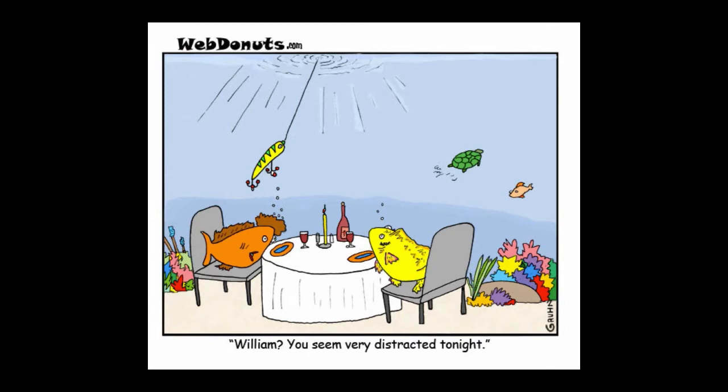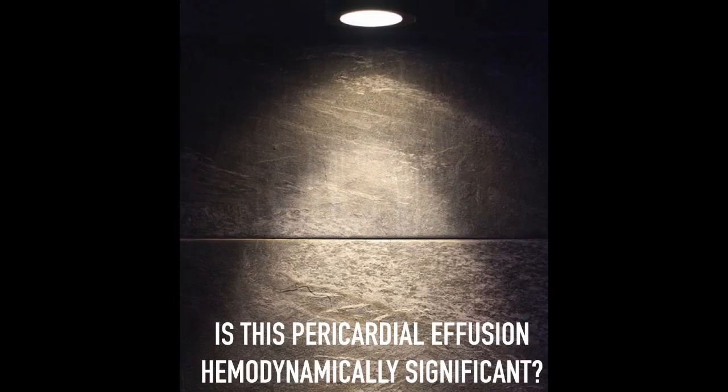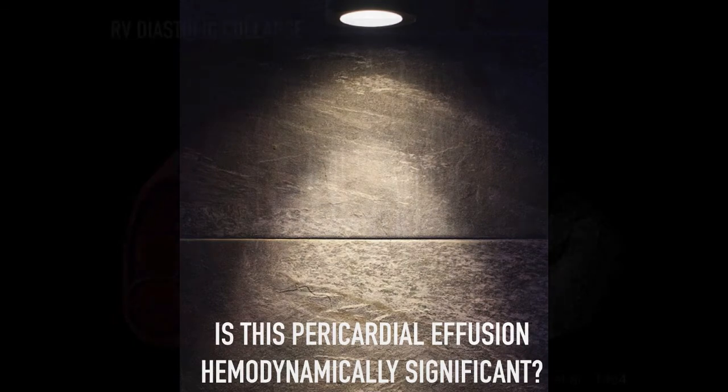There is ever-present risk of distraction with using echo to look for pericardial effusions. The important part to realize is that a patient with tachycardia should first be attributed to significant hemorrhage. Finally, it's often difficult to tell whether or not a patient has a hemodynamically significant pericardial effusion.